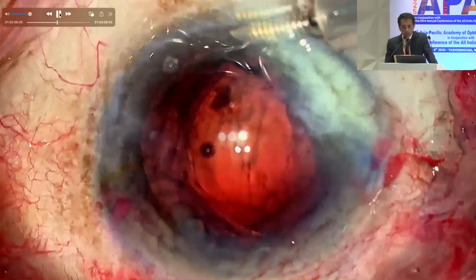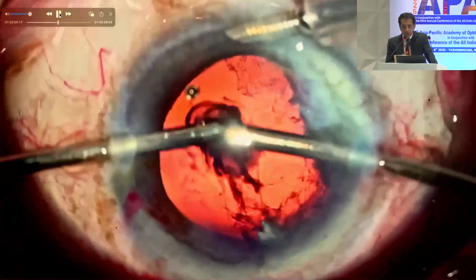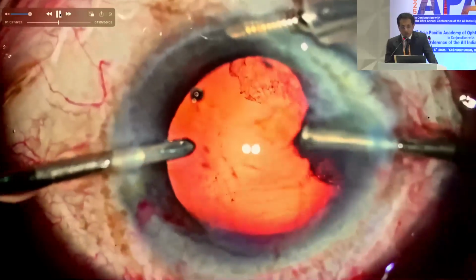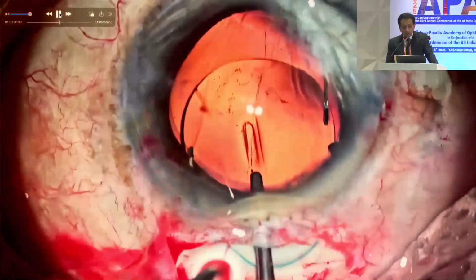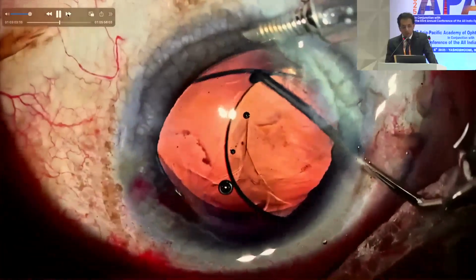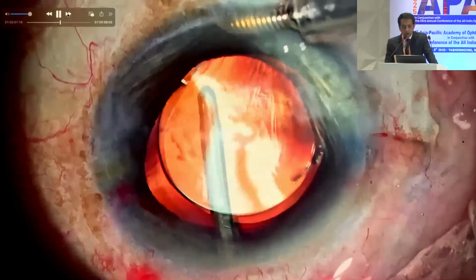So this is the stage at which the AC does not collapse, and that's the reason why I believe you have a better chance of preventing the posterior capsule rupture. Then the next steps would be as usual. There's nothing much in this case. This is something which I've tried and I find it very helpful.